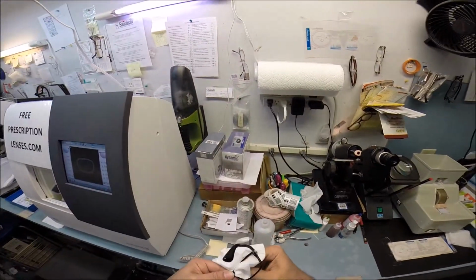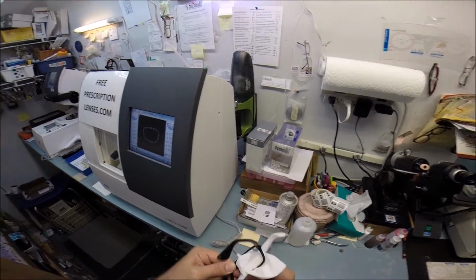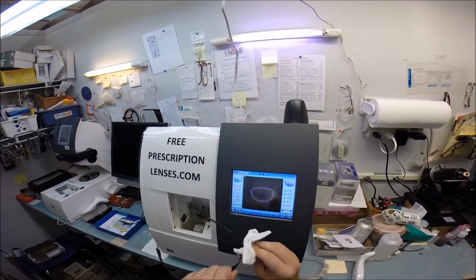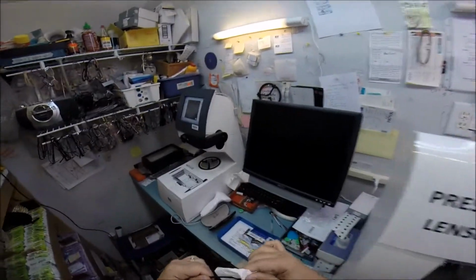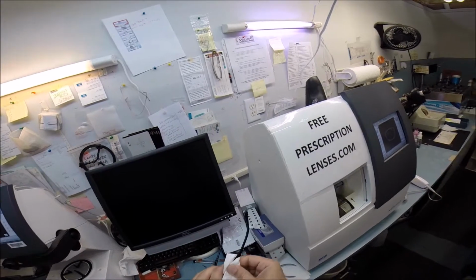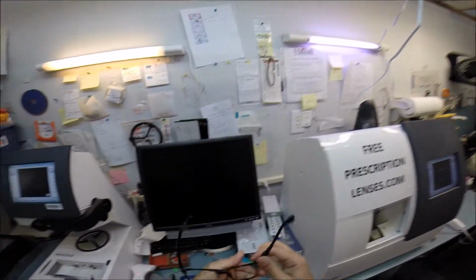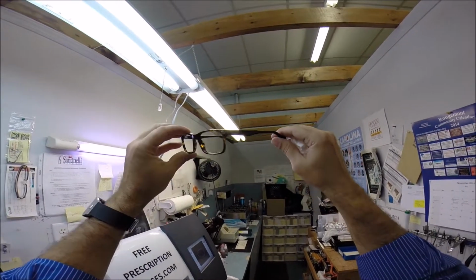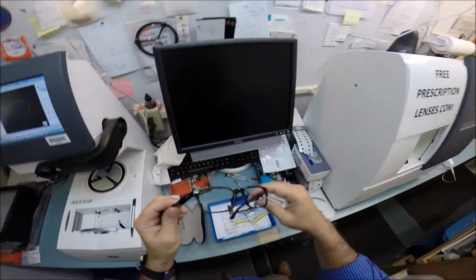But I'm going to clean out the inside of the frame because I just don't know what condition the frame is that you send to me. So I'm just going to clean everything up really nicely. Of course, this is one of Rayban's best-selling frames, model number 5228. The color is 2012, which is their dark Havana. And if you hold it up to the light, you can actually start to see the tortoiseshell. But indoors, my low light camera is not picking that up.